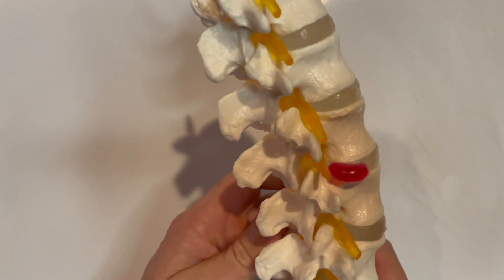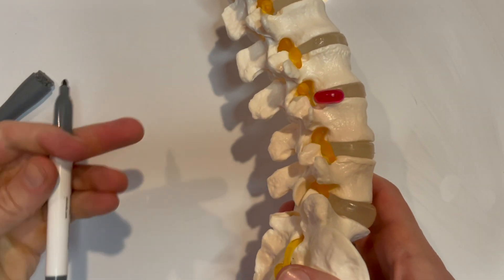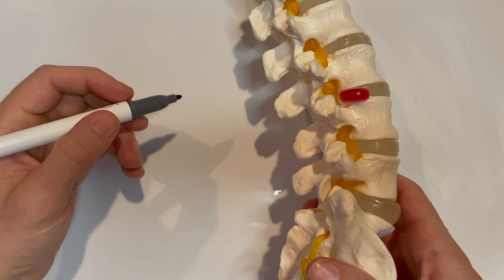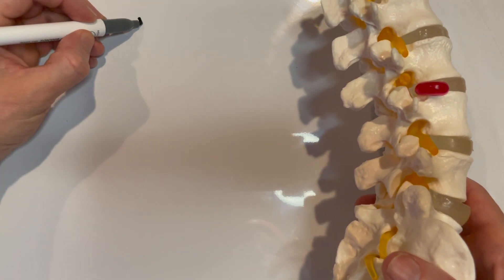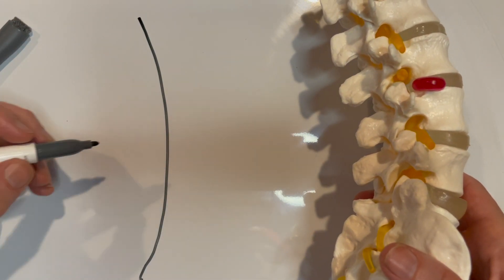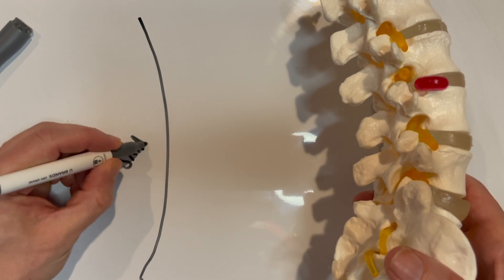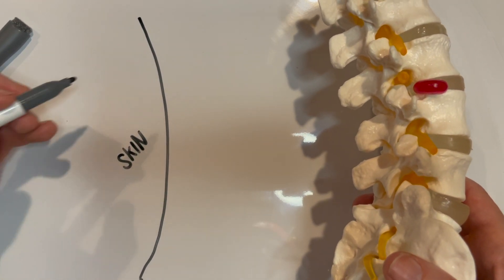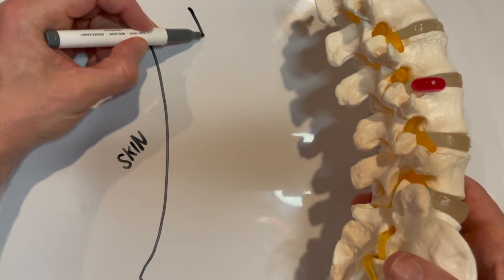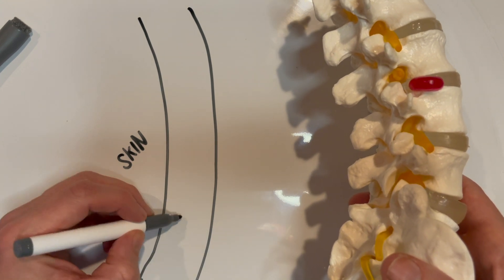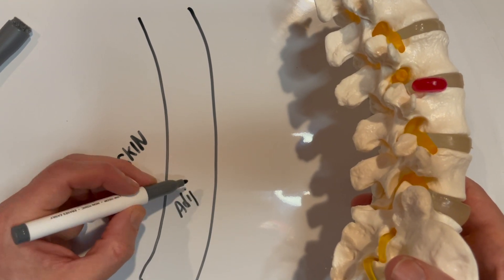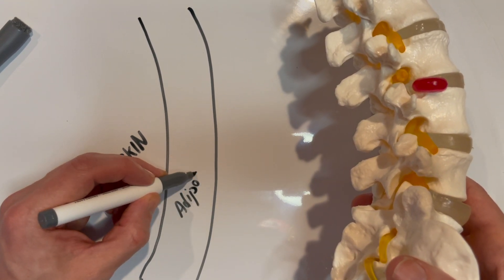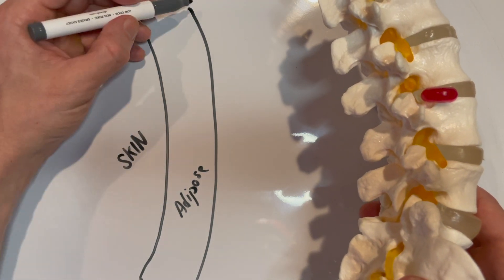Now we got the visual stuff down. As far as the tactile elements, the first thing we're going to hit is the skin, and then what's next up underneath that—depending on the person—we've got either a small or large amount of adipose tissue as our next round.